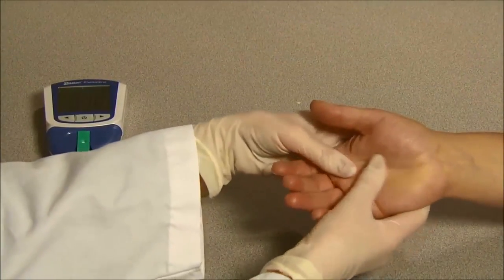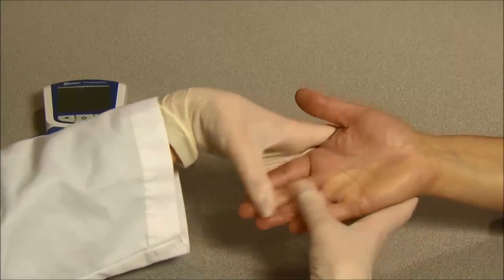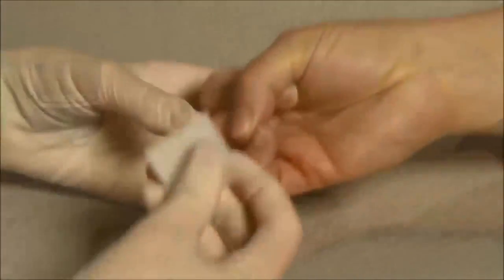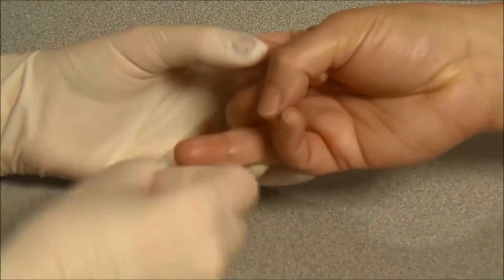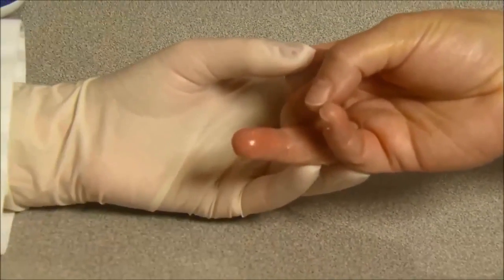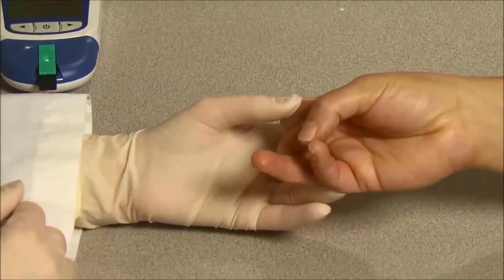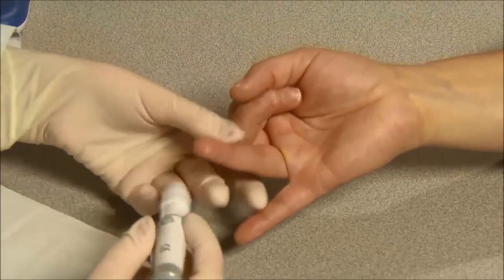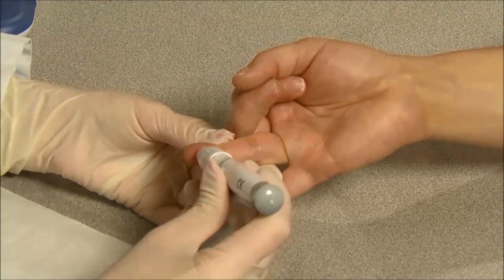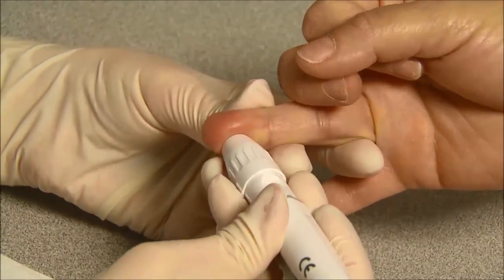Massage the hand from the wrist up to the fingertip a few times to encourage blood flow. Clean the testing site by washing your hands with warm soapy water and then dry them thoroughly. You could also choose to use an alcohol swab instead to clean the testing site and then let it air dry completely before testing. Hold the lancing device against the side of the finger with the cover resting on the finger. Push the release button to prick the fingertip.